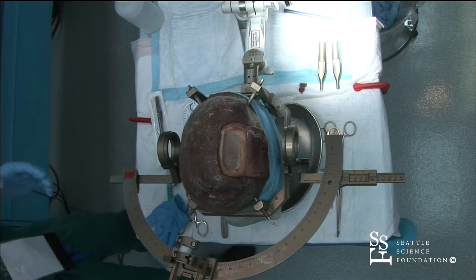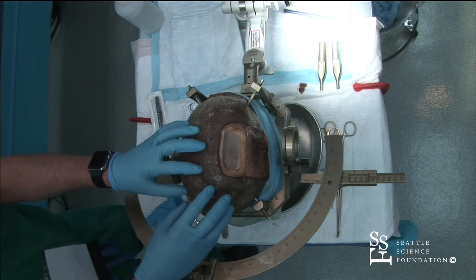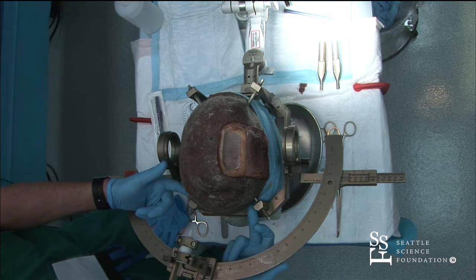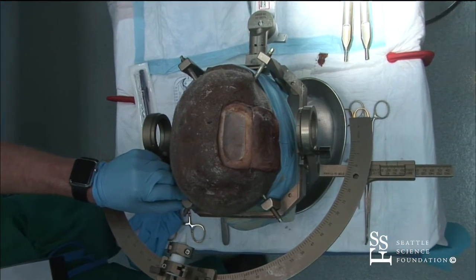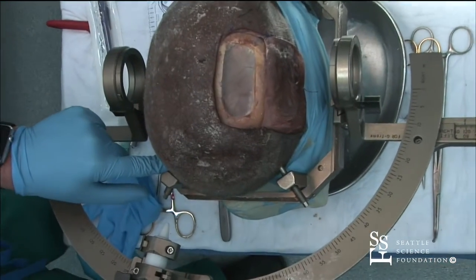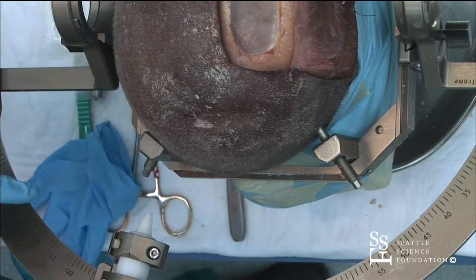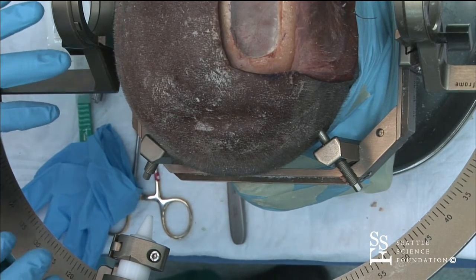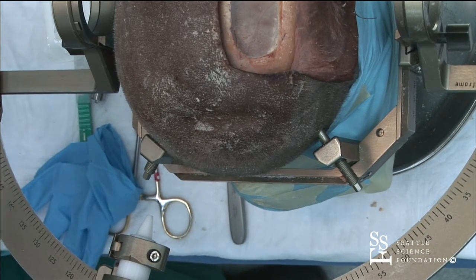The caveat is oftentimes, if you're going to be placing an electrode with the Leksell frame or any frame, CRW included, you generally need to get these screws in as low as you possibly can, because otherwise the arm's going to be in the way of the burr hole. And you can see here, we probably could have put these screws in a little bit lower and made it a little bit easier on ourselves. I've already kind of planned the entry here based on this trajectory. So thinking about putting on the frame as low as possible is a good idea if you're doing hippocampal depth electrode placements. It doesn't have to be done with the frame.